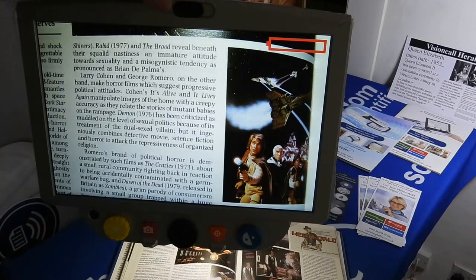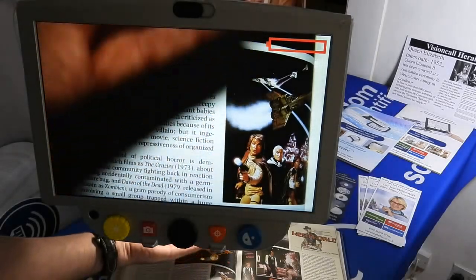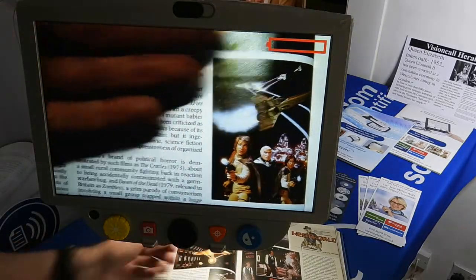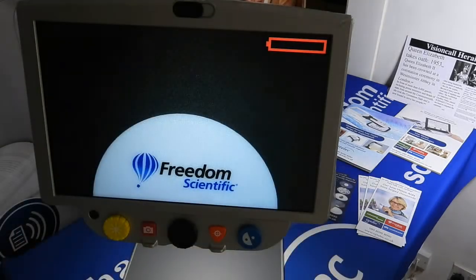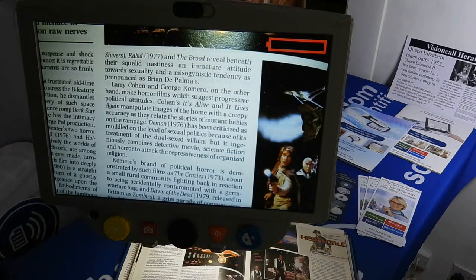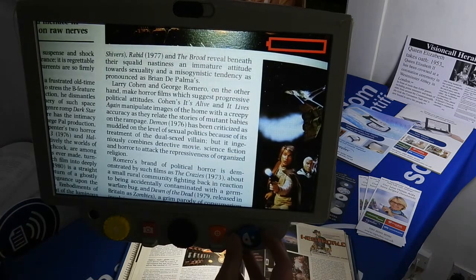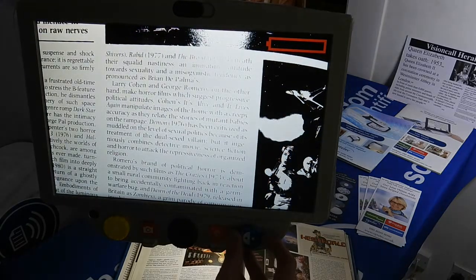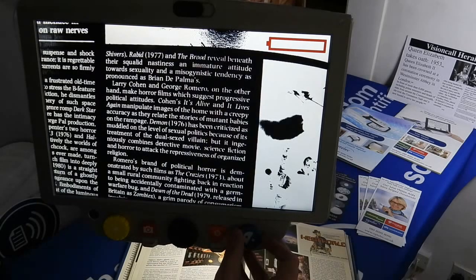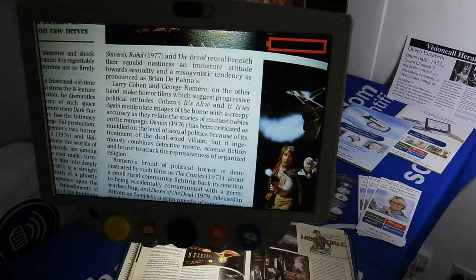The camera functions with the light source and the camera lens pointing directly beneath. Underneath here you place the reading material. It features auto focus. The blue button on the right-hand side adjusts the colour temperatures — your high contrast black and white, white and black, etc. — and it goes through a range of different colour temperatures.